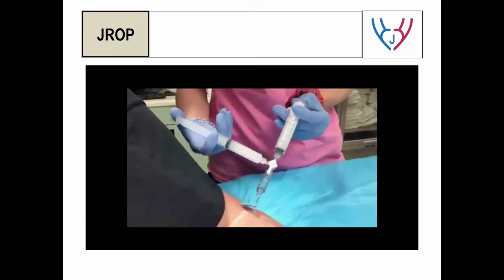Now, how do we do this study? First and foremost, we have two syringes joined together with a three-way cannula and connected with an infusion cannula into the vein. Then we take about 10 ml of normal saline, or 9 ml of normal saline in one syringe and half ml of air in another syringe, and mix them together to make bubbles. Look, this milky white saline structure is there. Then we push it into the venous circulation with a broad gauge needle, and preferably this cannula is inserted either between the wrist and the elbow or above the elbow if possible.